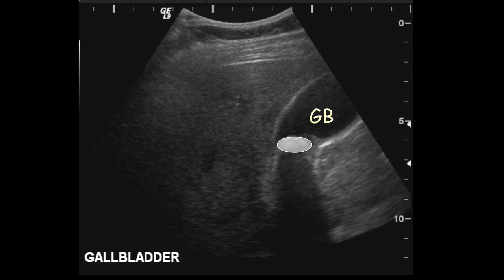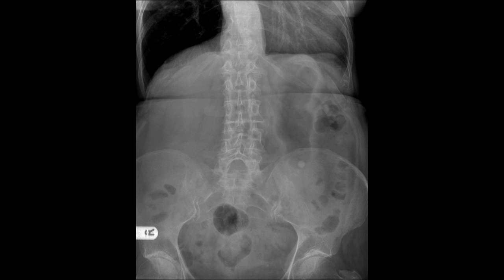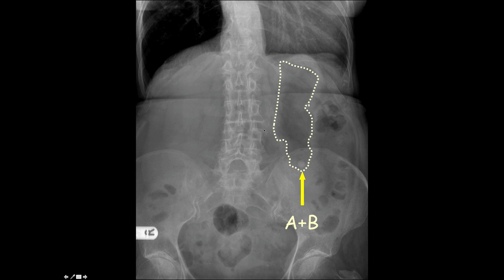On this abdominal x-ray, the bowel gas pattern is normal. There is a well-defined, very circular opacity visible — most of the time, if you spot a well-defined circular opacity, think about man-made objects. This is a tablet in the stomach, visible within the stomach gas shadow. So that covers A — additional opacity — and B — bowel gas pattern.